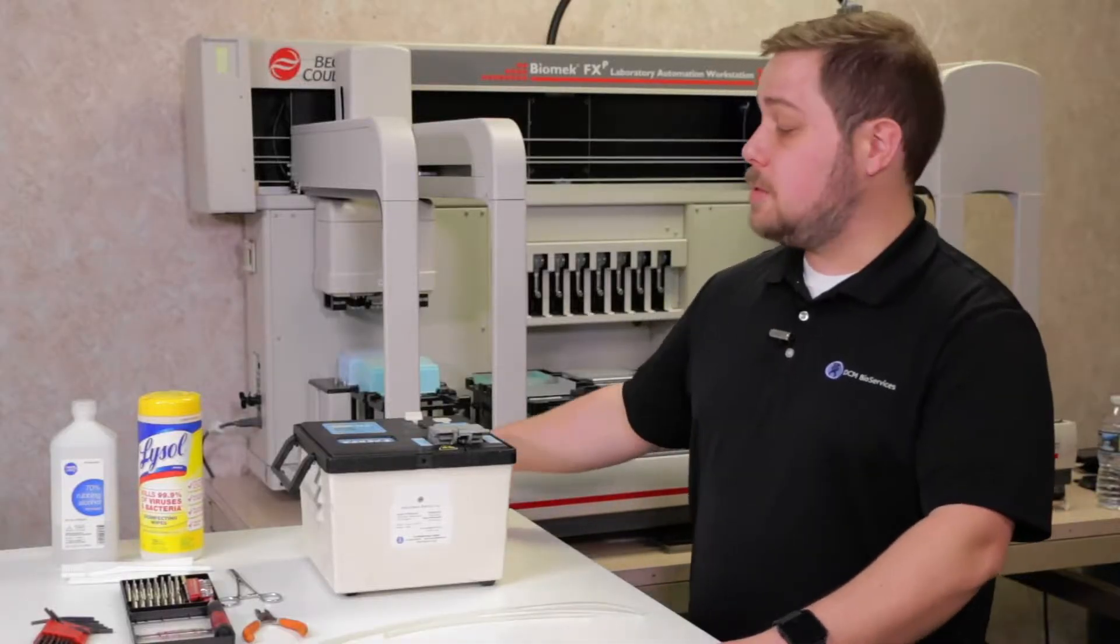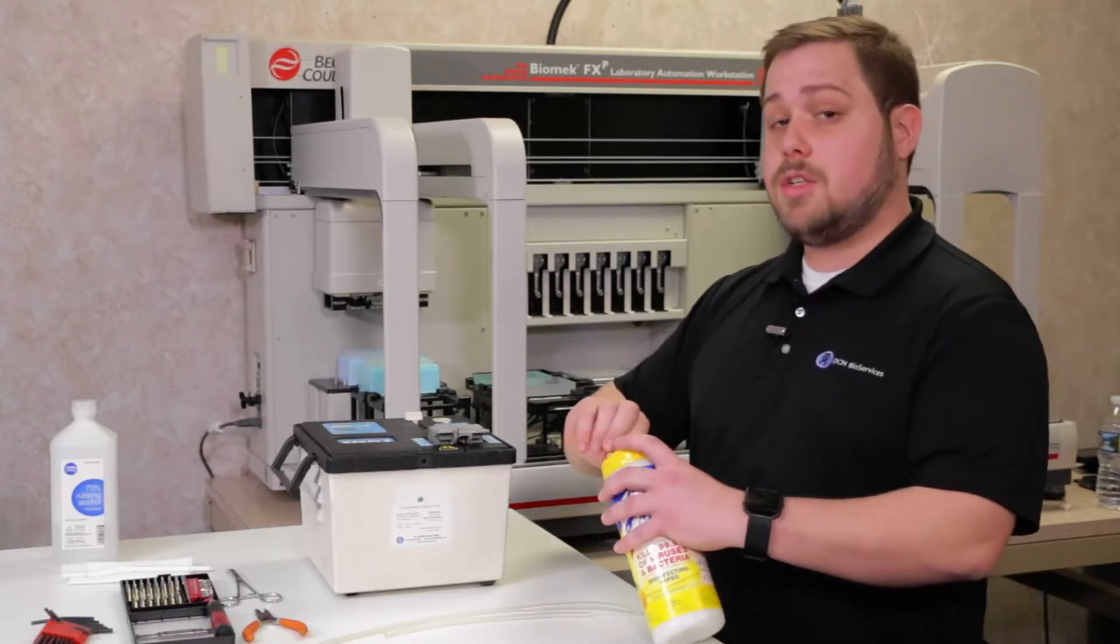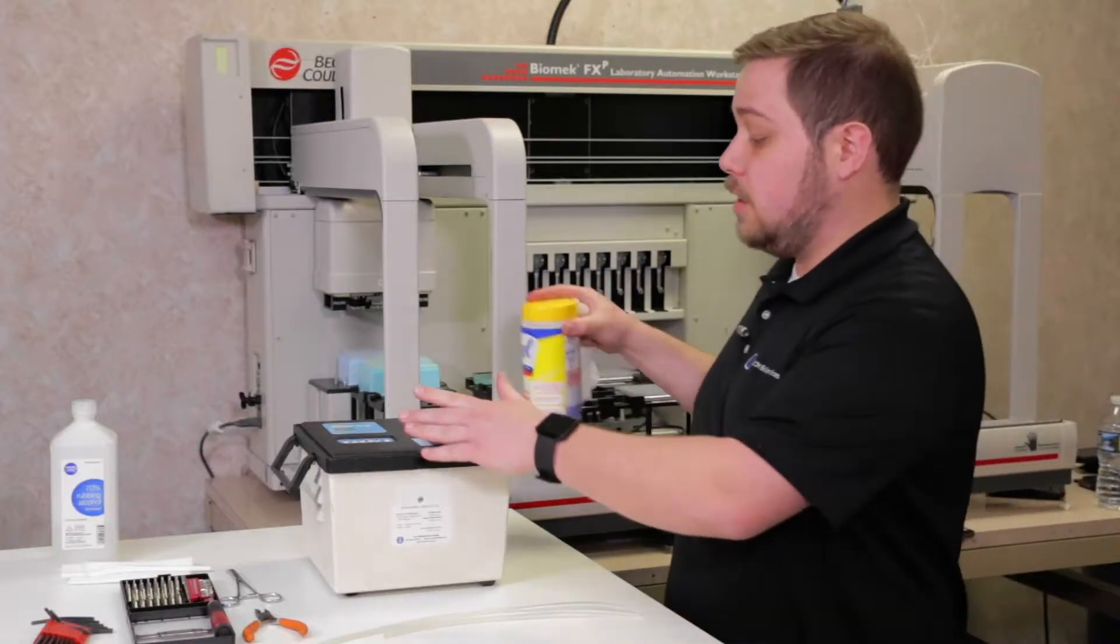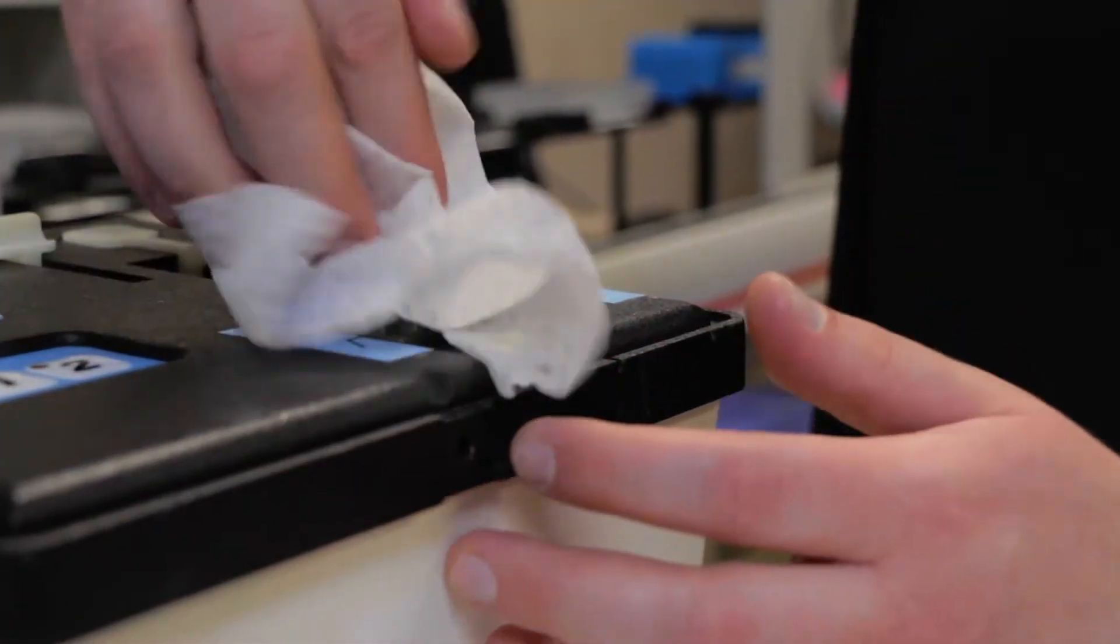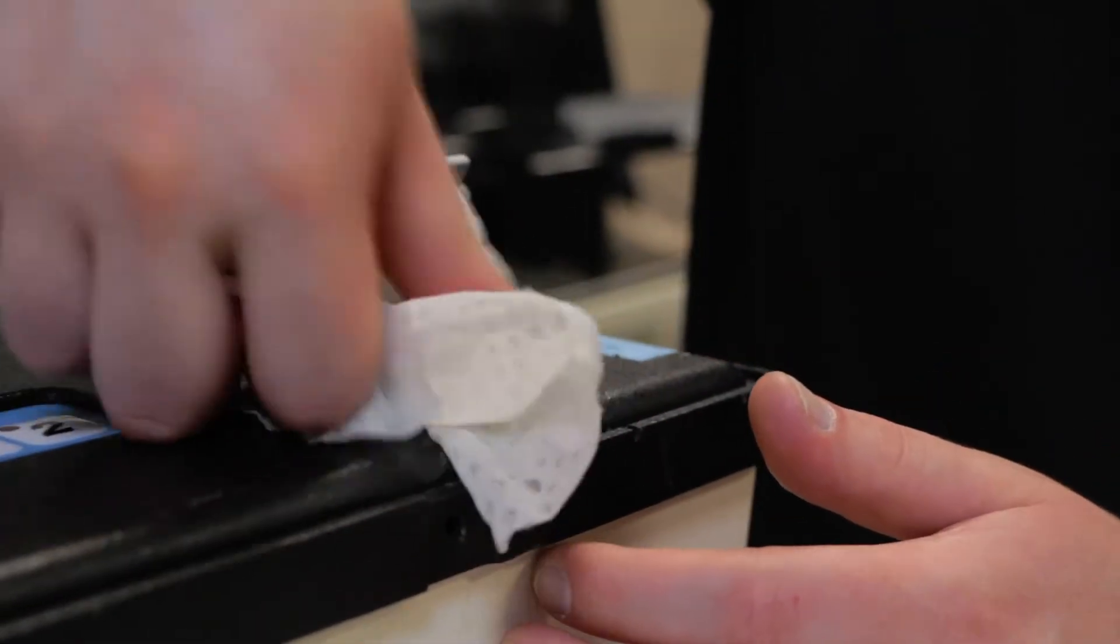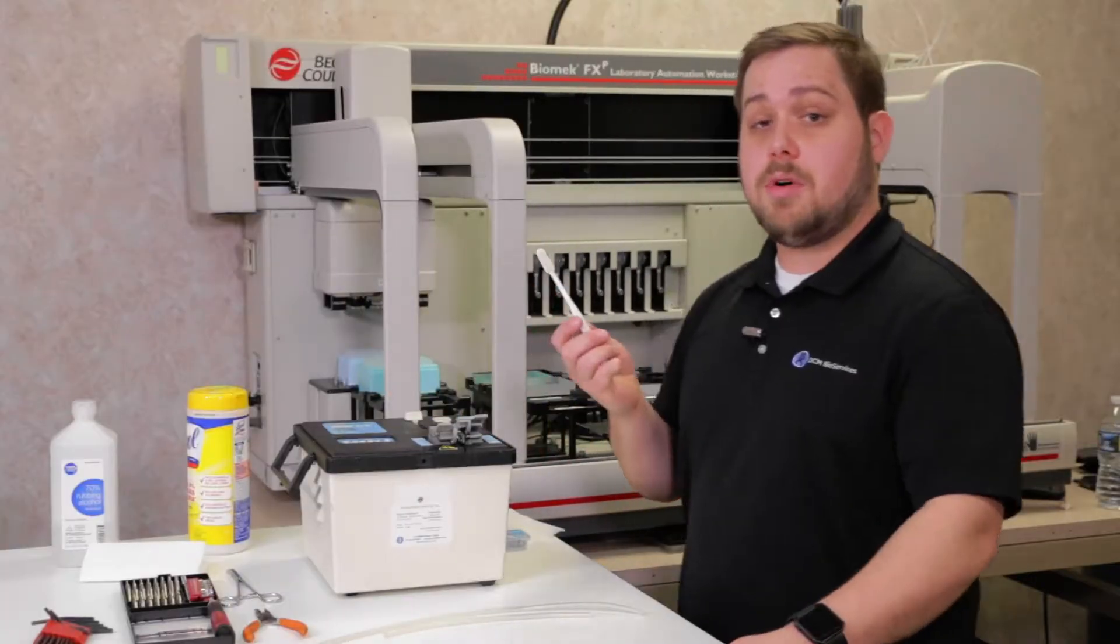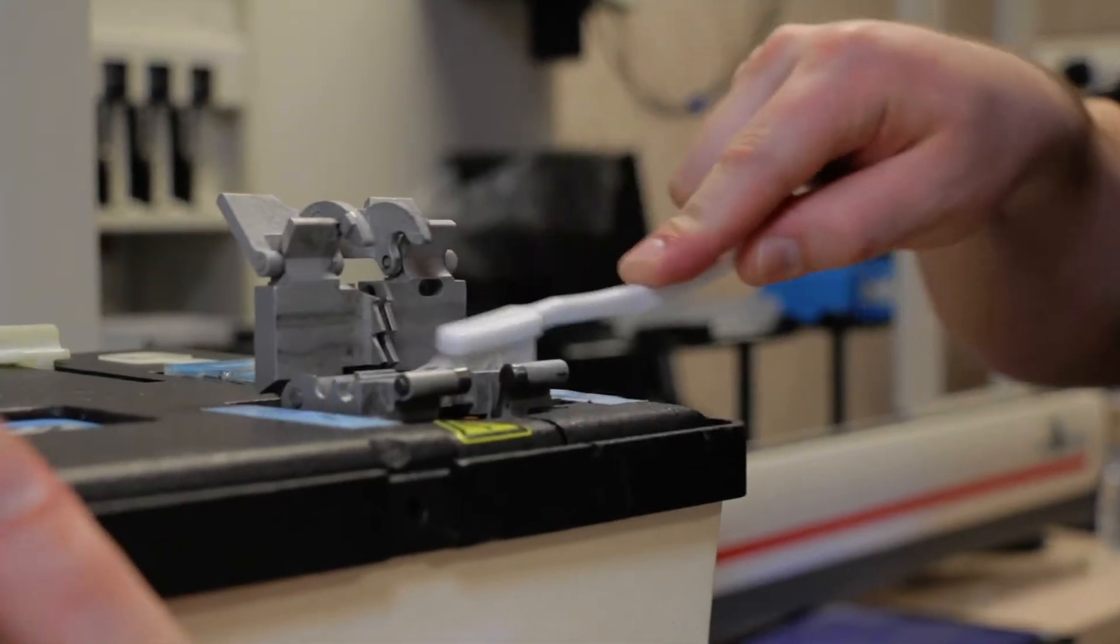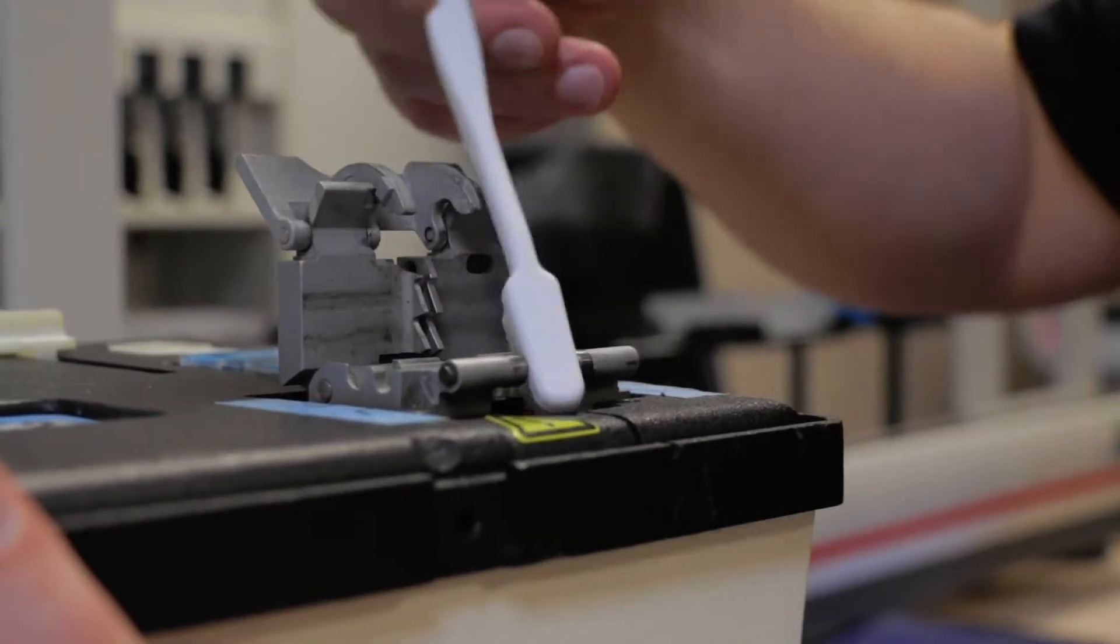When cleaning your welder, it's best to use some form of wipe. Avoid spraying anything onto the deck of the welder, as the control board and power supply are housed immediately below the top cover. Simply wipe down the carriers, the weld assembly, and anywhere else you may see contaminants. If a wipe isn't sufficient, you can use a toothbrush with a little bit of alcohol. Same concept, simply scrub any area that you see contaminants.